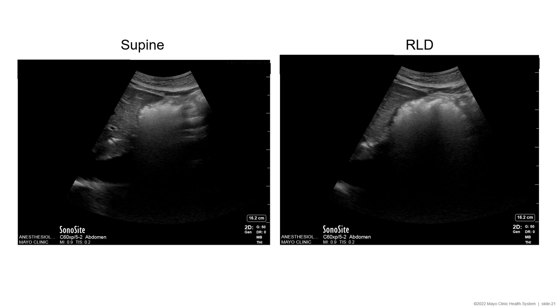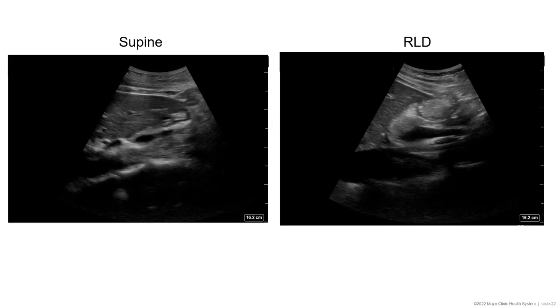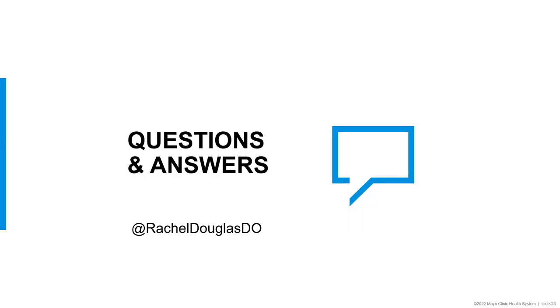In the next image, the dropout from the air and solids is a giveaway — this is a recently full stomach, which we can appreciate in both supine and right lateral decubitus positions. In the final case, we can find the stomach just distal and tucked under the liver tip in the supine position. In the right lateral decubitus view, we see a solid bolus of a distended antrum full of heterogeneous gastric contents, suggestive of a late full stomach — someone ate a meal a few hours ago.